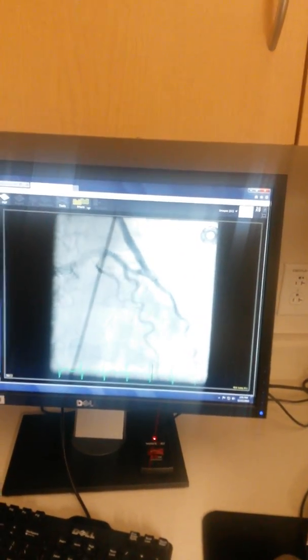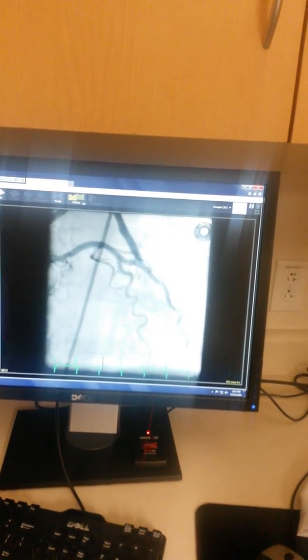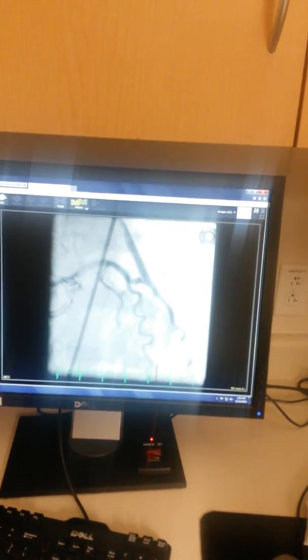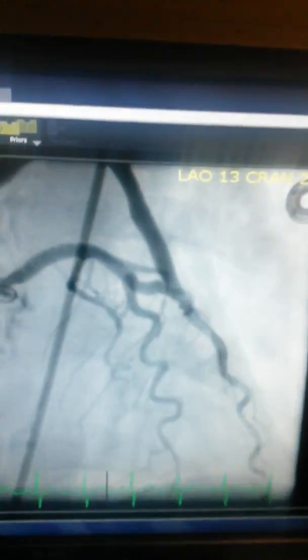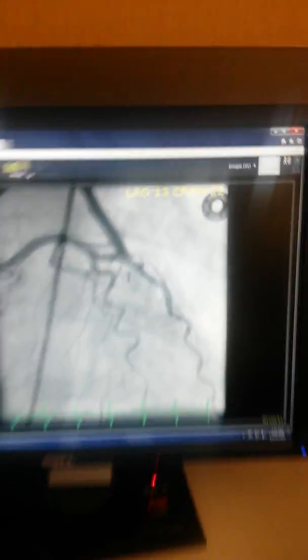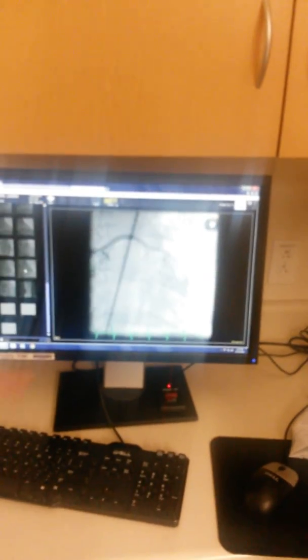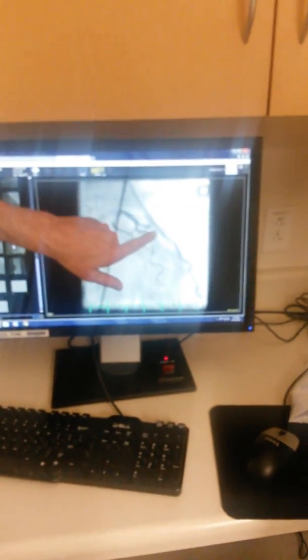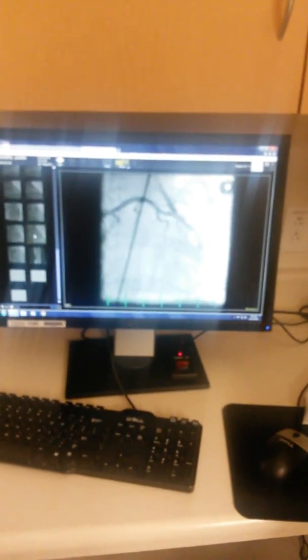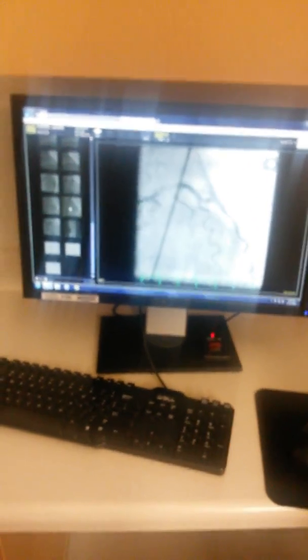Do you see that very often — where it feeds backwards up the loop? That seems almost counterintuitive that it would feed from the valve. Well, what we end up doing is we inject — not forcefully, but we certainly displace the blood. And if there's enough pressure there, it'll displace that blood all the way back up. The goal is to look at this area here to make sure we've got a good result. You're pushing it. That's right, and that's the concept — that's how we image it. By displacing the blood, which doesn't absorb x-rays, but the contrast absorbs it.